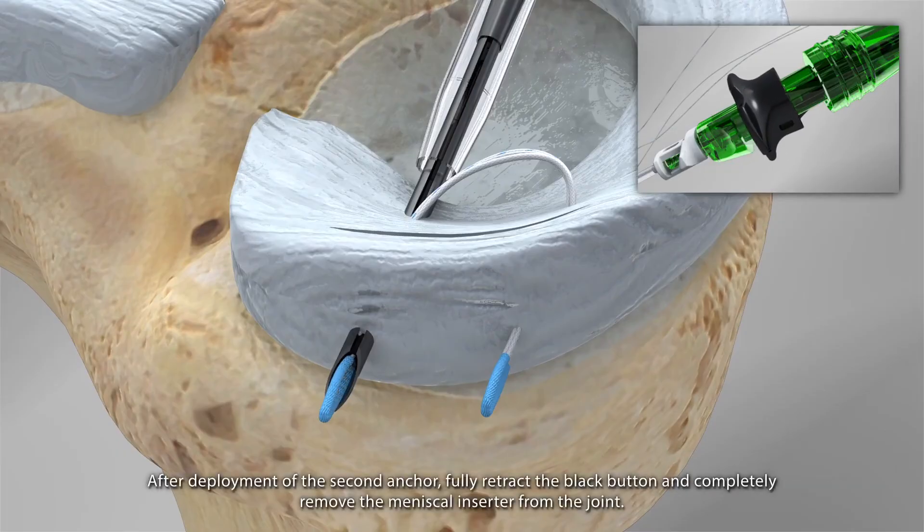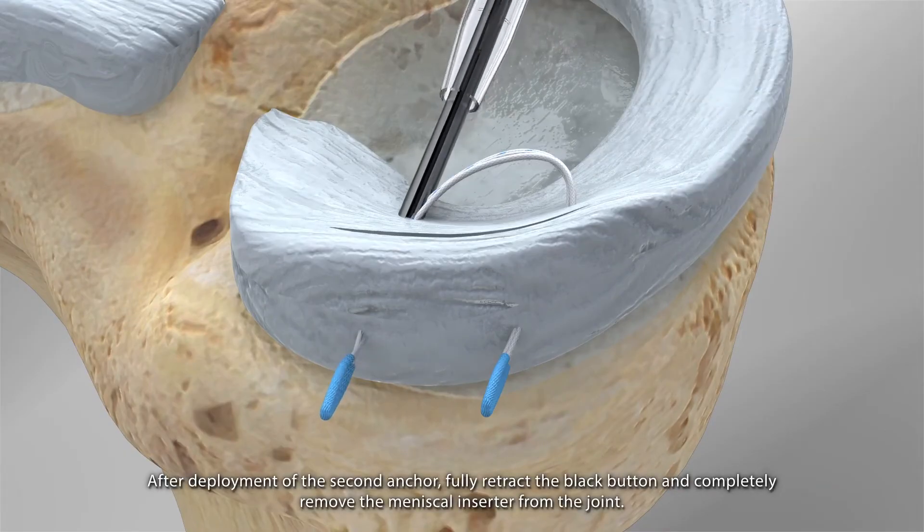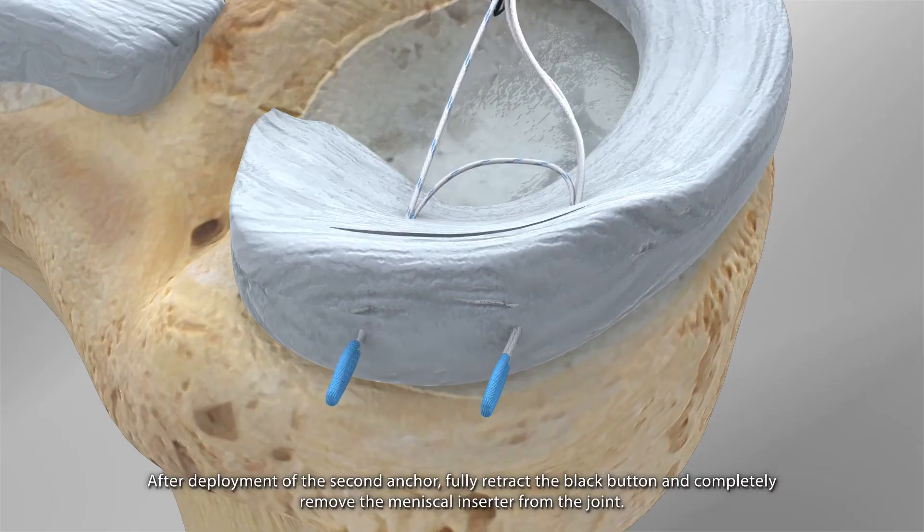After deployment of the second anchor, fully retract the black button and completely remove the meniscus inserter from the joint.